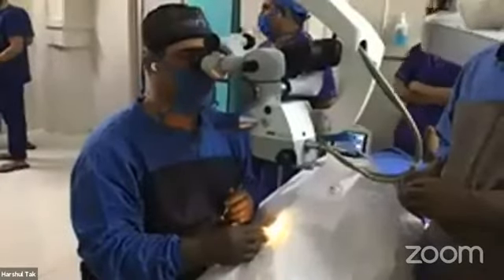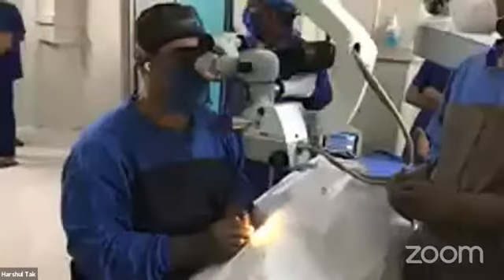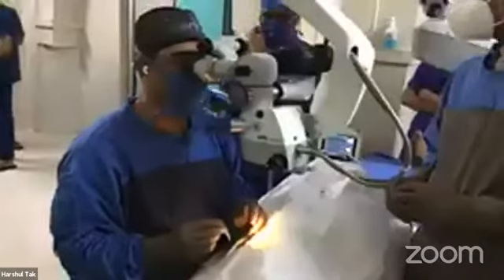So this is a plan for toric IOL implantation. You can see these are the marks, 0 and 180 degree reference marks, which we have done. These are very thin marks. And before we put a mark, we always put a scratch there. If you can appreciate, there are some scratch marks here, so that these scratch marks never go away, even if the ink fades.